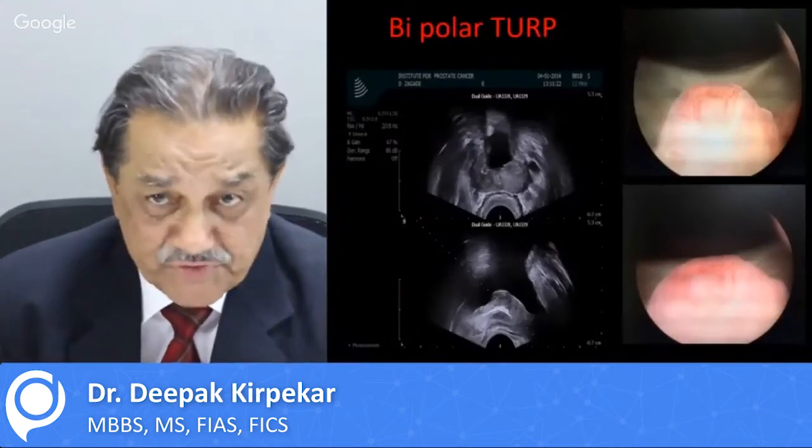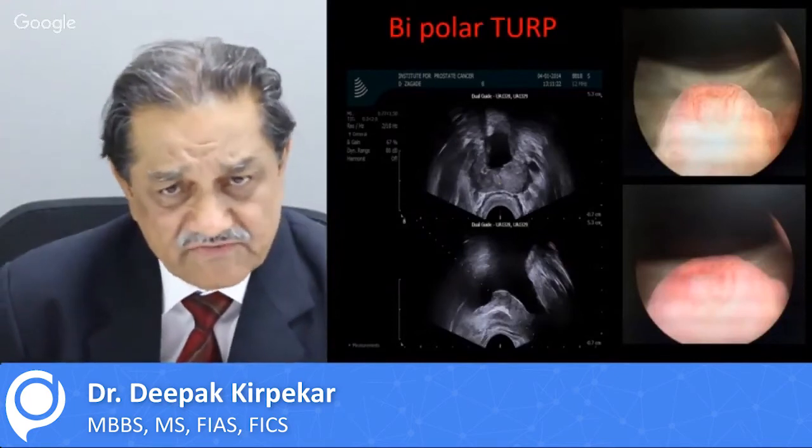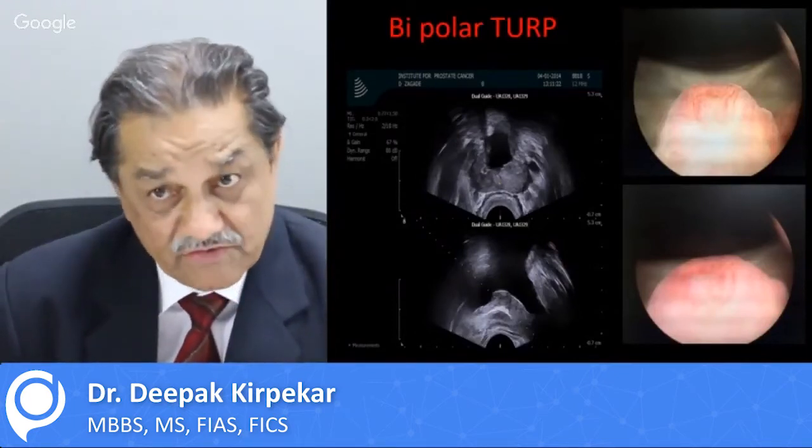These are the pictures of a post-operative prostatic fossa, showing the transrectal ultrasound images, how big the fossa is and how good the fossa is.